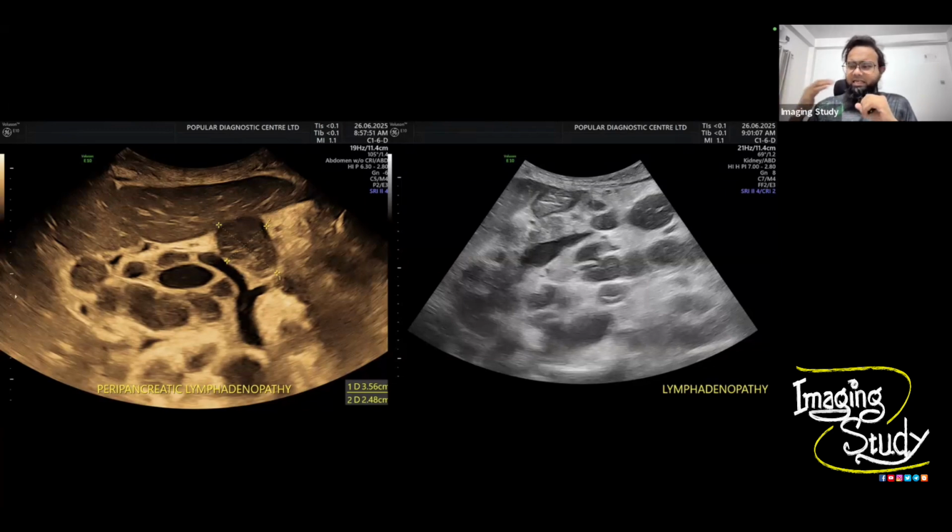But are there two malignancies in this patient? Like we have seen the thyroid malignancies. Whenever you see cystic lymph node enlargement, you should be very confident because that is due to the papillary cell carcinoma metastasis. But this one is not related to that papillary cell carcinoma. It won't cause you this type of massive lymphadenopathy. So the patient is having another abnormality, I think.